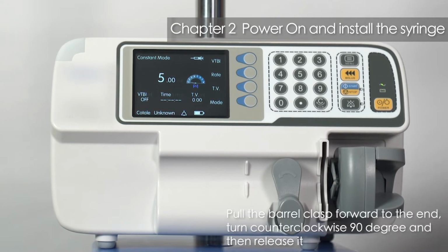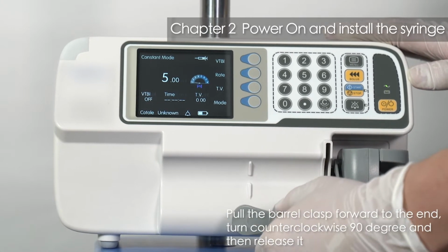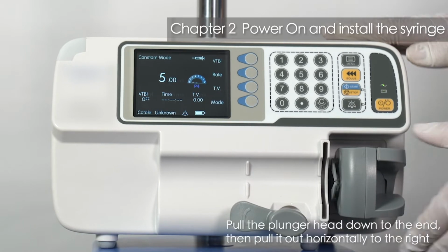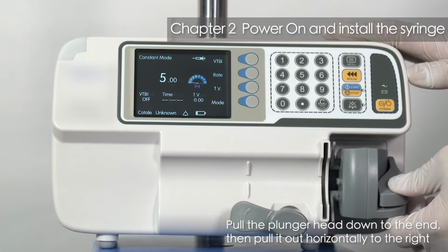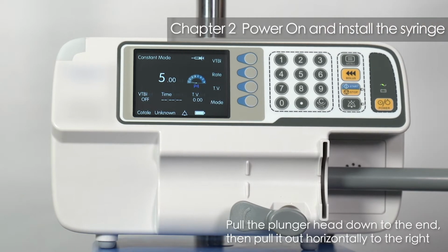Pull the barrel clasp forward to the end. Turn counterclockwise 90 degrees and then release it. Pull the plunger head down to the end. Then pull it out horizontally to the right.